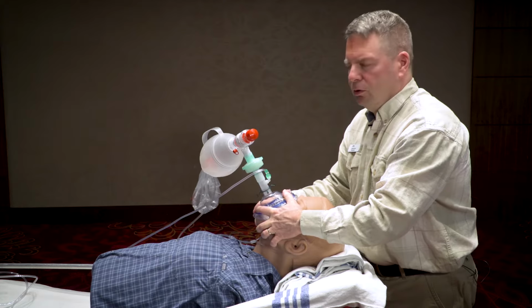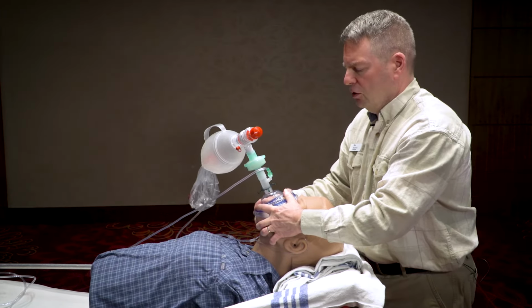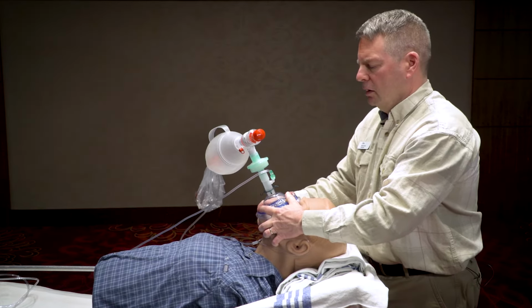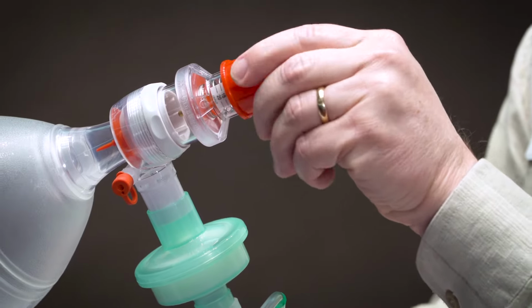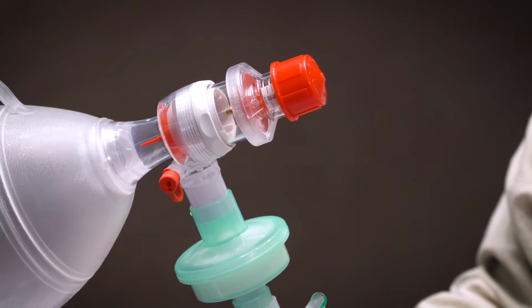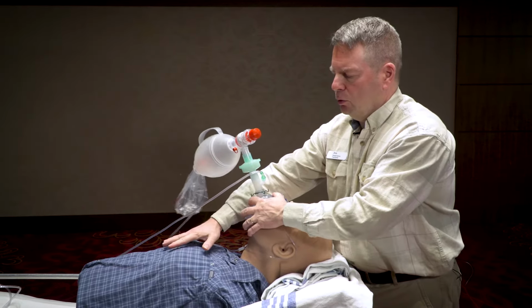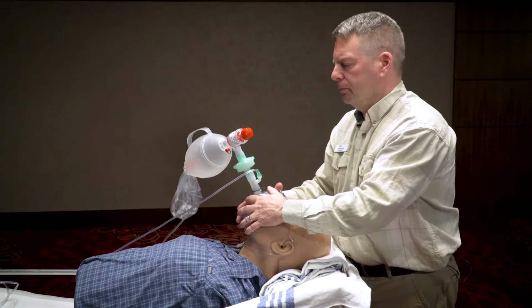So it might take a few people to do this, but it could be easily done in a setting where you have limited resources. Maybe you don't have a BiPAP machine or ability to do CPAP in any other way. You can do it just with the bagger like this. And then depending on what their saturation is, you can increase the PEEP level or CPAP level from 5 up to 10, 15, 20, and each level would give you a larger and larger lung volume for oxygenation.